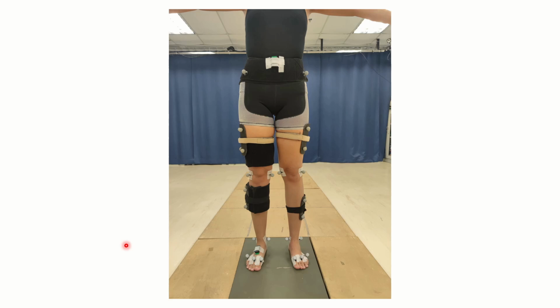And tip number 11 is the use of these black Velcro bands, which were placed around the EMG and IMU sensors. While conducting our trials, what we realized was that the EMG and IMU sensors tended to give weird or weak sensor readings as they became dislodged or loose even with the use of surgical tape. This was because of sweat and the subject moving around in general. So to ensure that these sensors were pressed firmly against the skin and did not slip, we used these black Velcro bands and wrapped all the sensors within them.